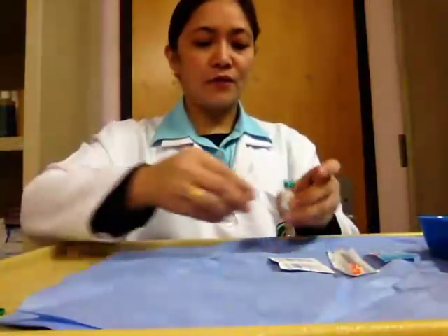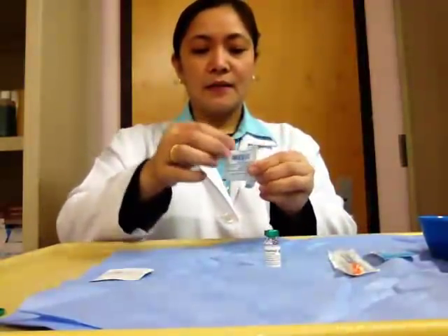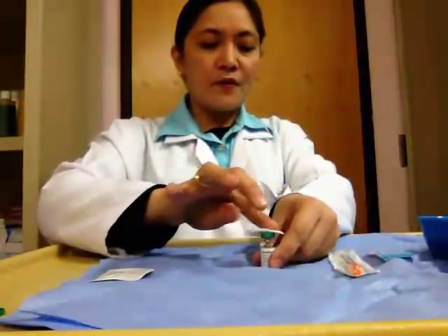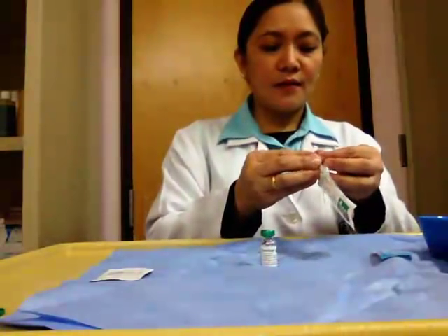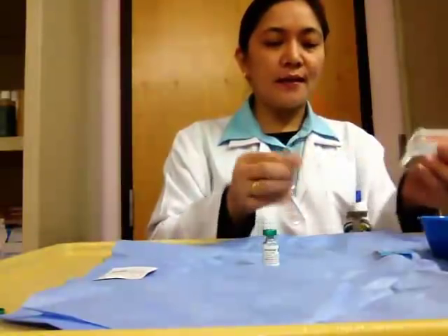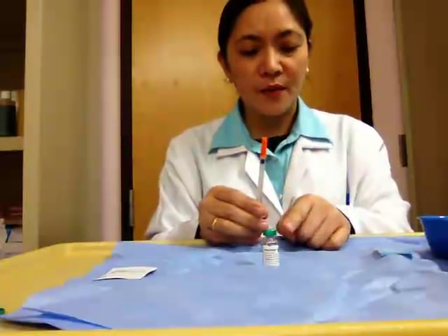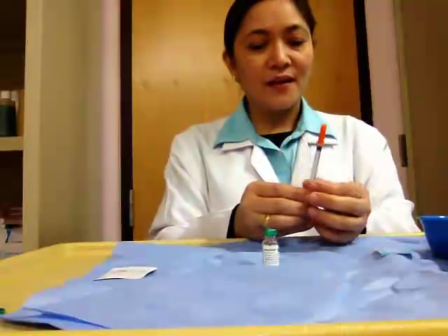So we have to remove the cover of the vial and then wipe the top of the vial. Open the insulin syringe with the needle attached. This needle cannot be removed and cannot be replaced. So we can use this one as an aspirating needle, and at the same time, we are going to use it as the injecting needle. So how much is the doctor's order?